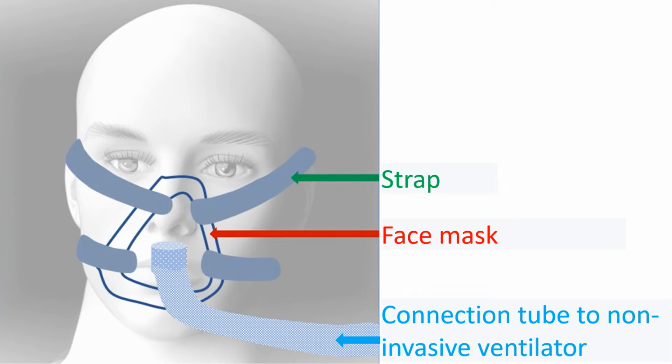Small non-invasive ventilators running on mains with battery backup are being used by many sick long-term care patients at home. Caretakers can be easily trained to apply the mask and check for air seal.